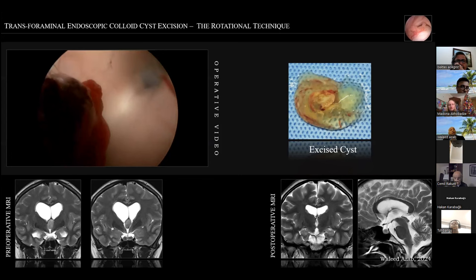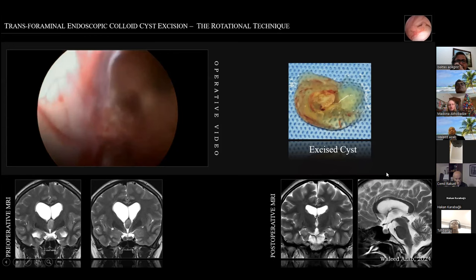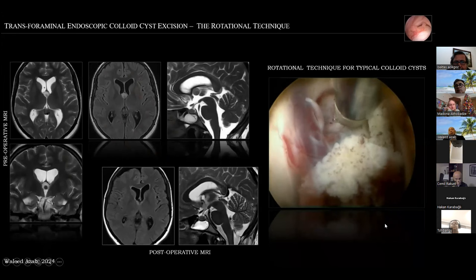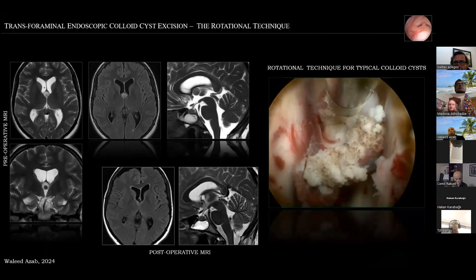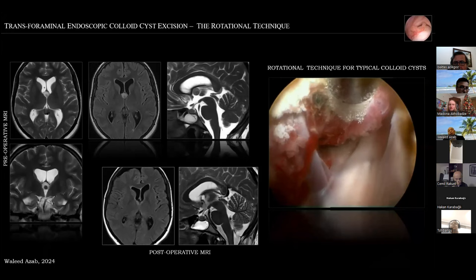The cyst has now completely separated and is being taken out across the track of the endoscope. Here is the view into the resection area and the floor of the third ventricle. Pre- and post-operative MRIs are shown. At times the situation is more difficult with bleeding; the key surgical technique to help complete resection is to perform patient and prolonged bipolar coagulation of the capsule and the attached choroid plexus.